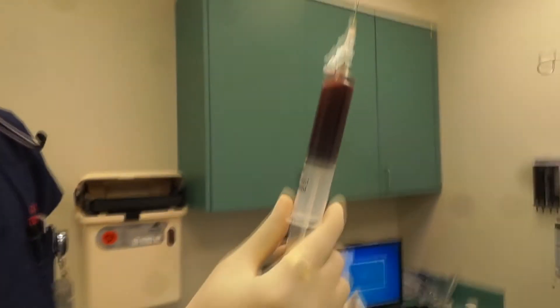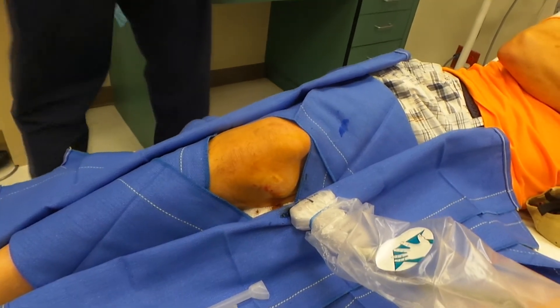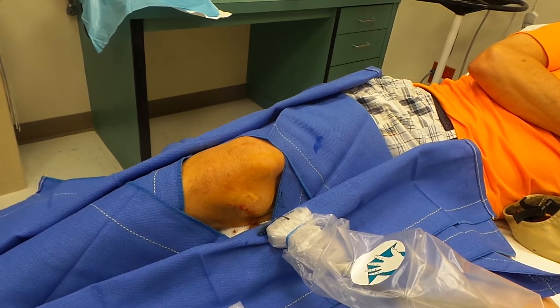We got almost 23 cc's of frank blood. There's still a small amount of fluid in there, but I do think a compression wrap with an H-wrap will help — the body is going to take it out and absorb itself.